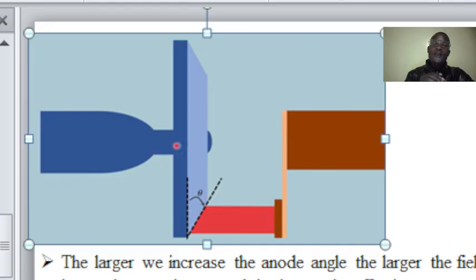Now the amount of kinetic energy that is reduced is not going to waste. Those are the ones that are being converted into heat and the X-ray itself. Now within that sphere, X-ray only forms 1% of the total kinetic energy with which the electrons are accelerating.